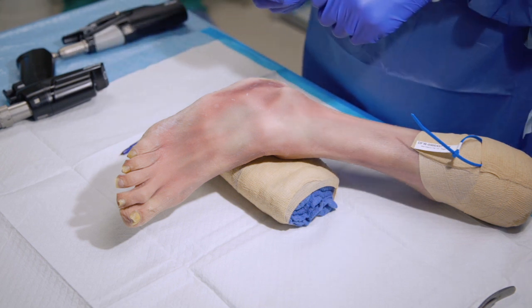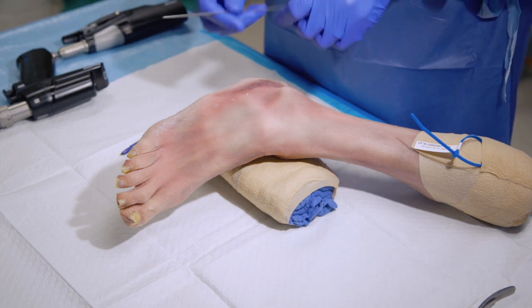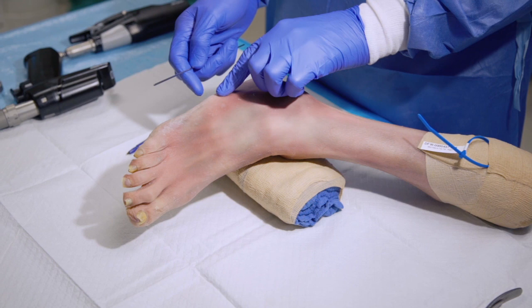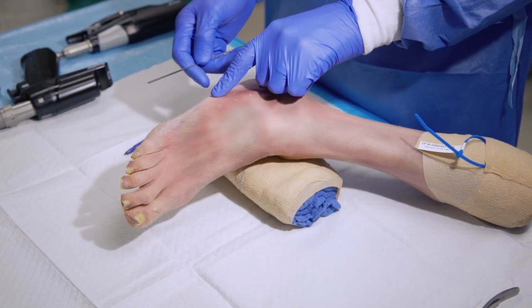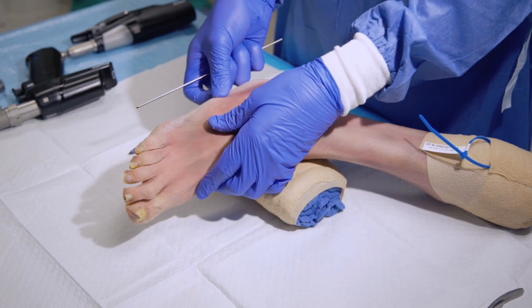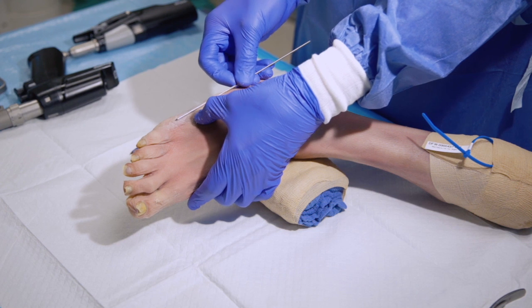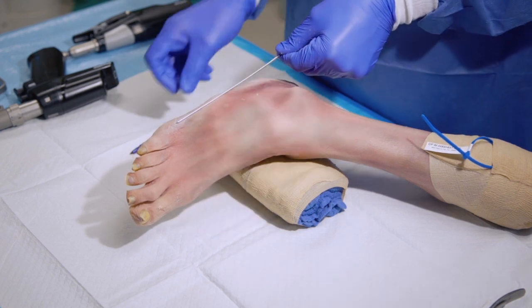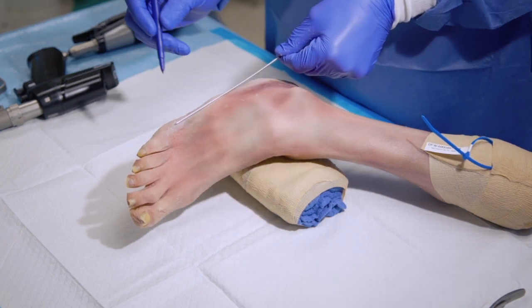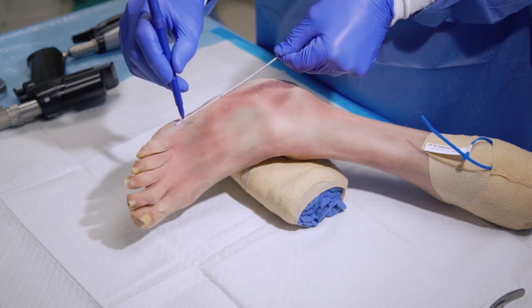You can utilize fluoroscopy for landmarks in lining up your incisional approach, or just basic physiologic anatomy. So if we look at the fifth metatarsal base, we can palpate the base, the head of the fifth metatarsal, and then we can use one of the wires from the set as a rough guideline as to where the bisection of the fifth metatarsal will be in the sagittal plane.